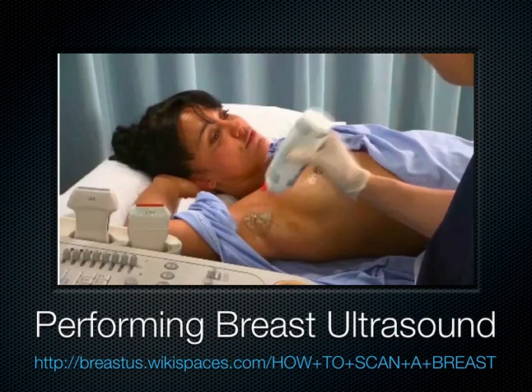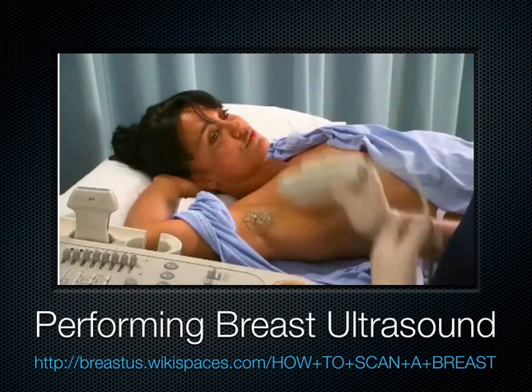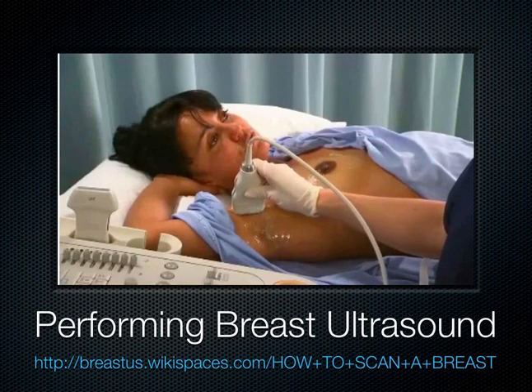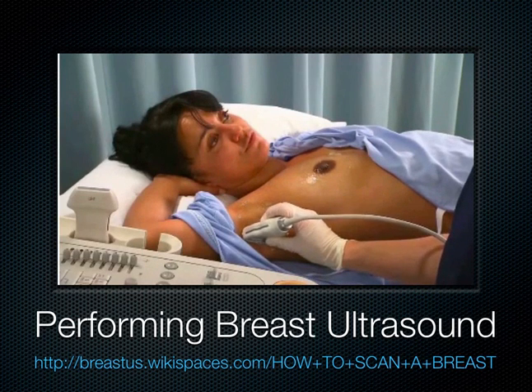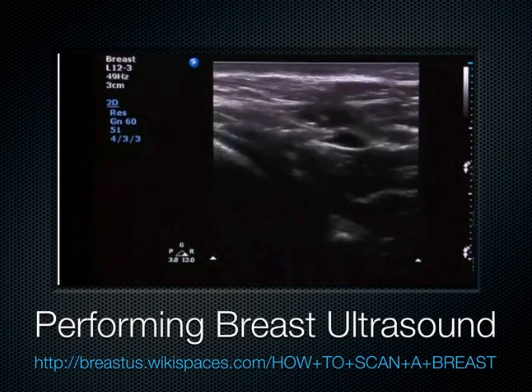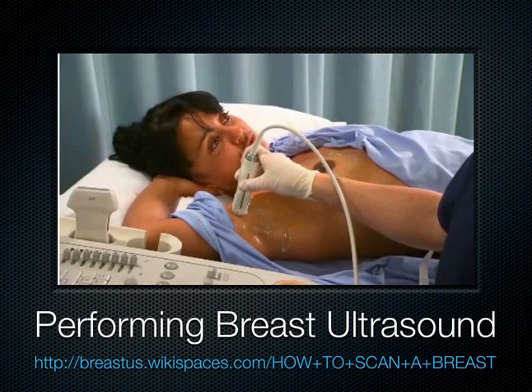Apply gel to the right axilla. To scan the axilla, place the transducer in the longitudinal plane of the superomedial aspect of the axilla with the notch pointing superiorly. Using a grid technique, slide the transducer horizontally towards the superolateral aspect. Then slide it inferiorly to the inferolateral and finally to the inferomedial aspects of the axilla. Repeat the process in the transverse plane.